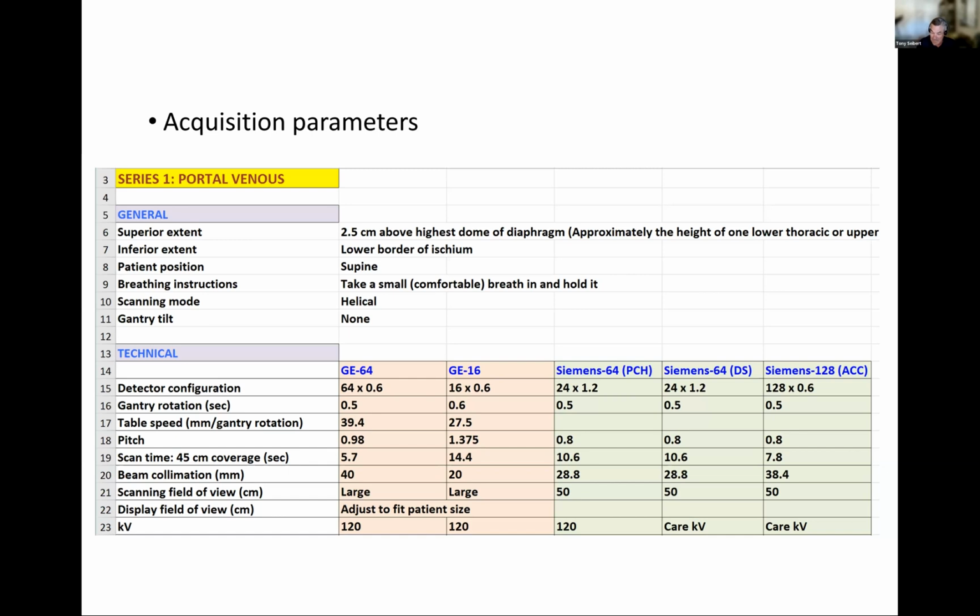There's even more coming on the next slide, but this is shown for some of the scanners at UC Davis Health, including the General Electric and Siemens scanners as shown. We have a much wider fleet of scanners now. This again is the 2014, 2015 version, and updated. We also have a high resolution Canon scanner, which really changes the way in which we acquire, and our technique factors are somewhat different because of the much smaller pixel and voxel dimensions in those scanners. The more recent documents have these systems listed in our up-to-date collection of protocol guides.